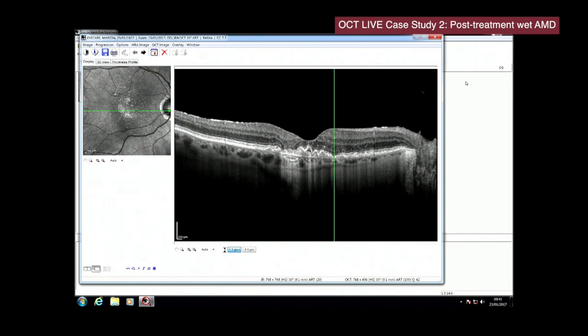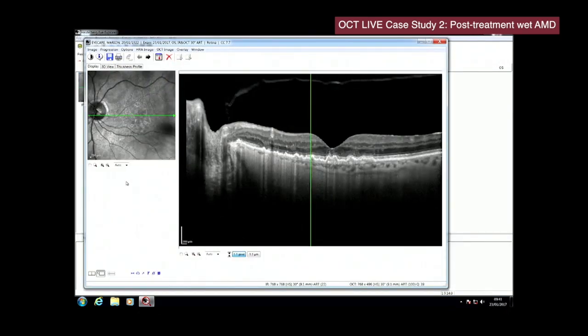And I think this is the right eye, and similarly the left eye. Could you bring the left eye, please? Again, in the left eye, you can see that there are some subtle RPE changes, but no sign of intra or subretinal fluid here. So both eyes have responded well to 3 Eylea injections, which we gave at monthly intervals. And now, as per protocol, we have listed her for another 4 injections, which will be every 2 months. And we'll see her in the clinic in around 6 months' time, unless she notices any distorted vision before that. But she's already on treatment, so effectively we don't have to do anything till she comes back to us in 6 months' time.